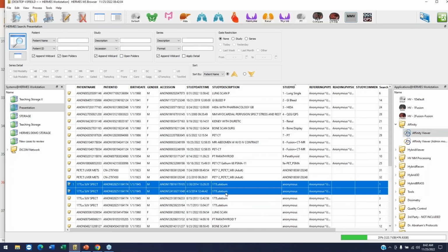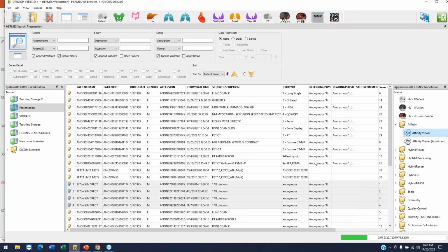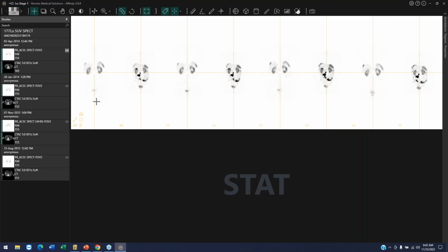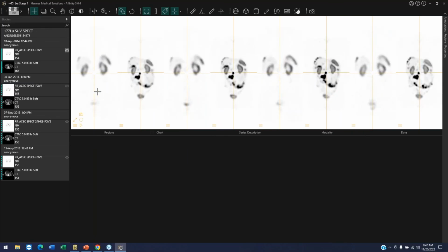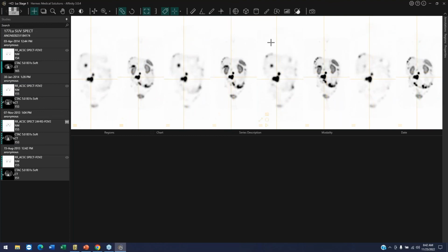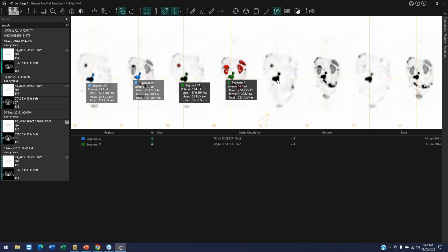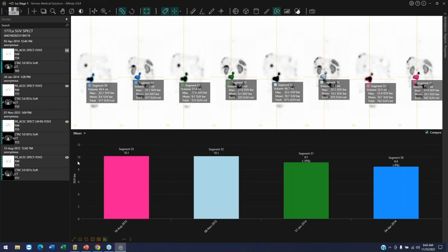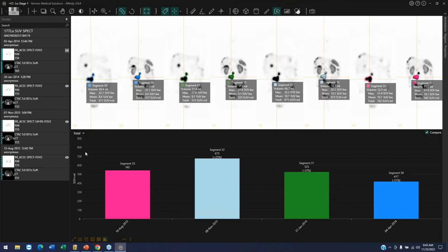An additional example is looking at lutetium images across multiple time points. It's lutetium SPECT across 4 time points. So I'll just focus on one lesion, this particular one right here. And I will mark it across multiple time points. And one can graphically display data regarding SUVs automatically, whether it be mean, or if you want to look at the max SUVs, or lesional glycolysis. So very easily you can display data across multiple time points and assess how the patient is doing.